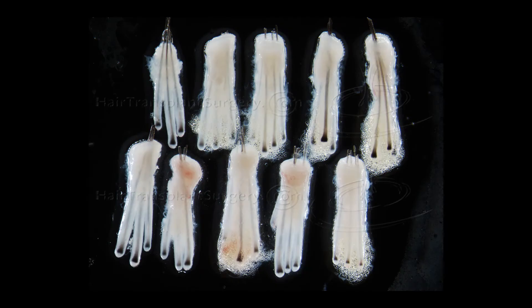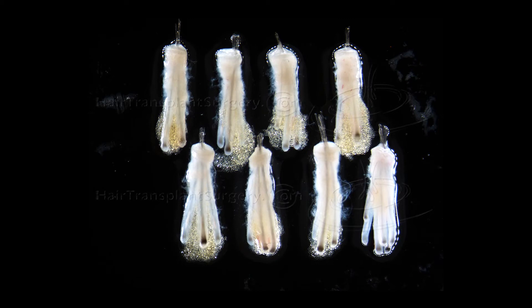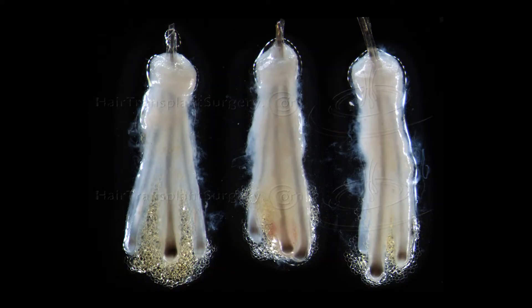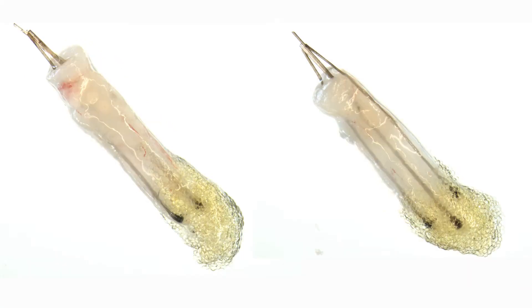The goal of this invention is to obtain FUE grafts similar to FUT grafts — to reduce both the transection and pairing rates, as well as all the injuries follicular units can undergo during extraction. All this for the one and only reason that must guide us: reducing the number of missing grafts and increasing the intrinsic quality of the extraction.